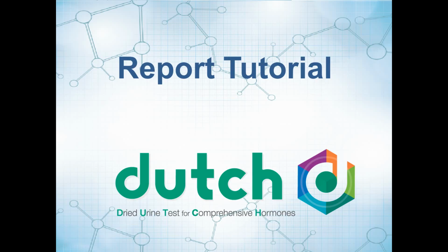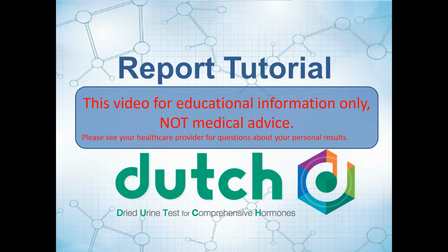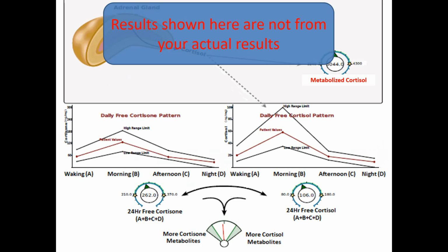This is a Dutch testing report tutorial to assist you as you try to interpret your Dutch hormone testing results. These are for educational information only and not to be taken as any sort of medical advice. The results that we're showing on the screen are just example results, not from any particular patient.